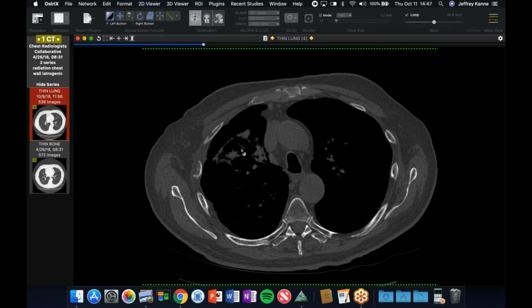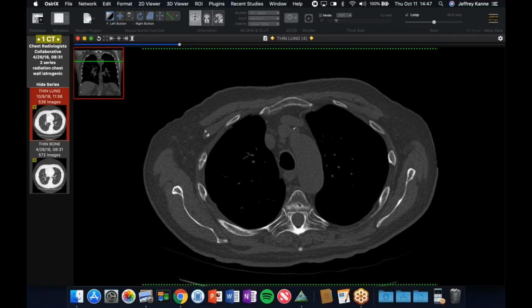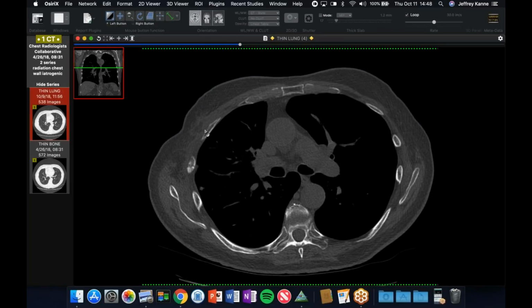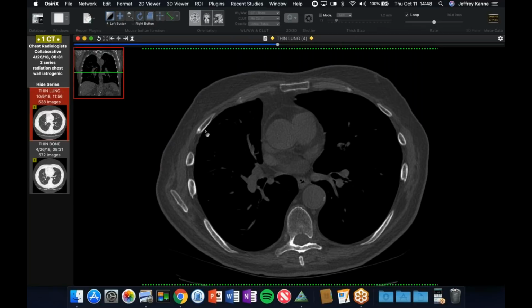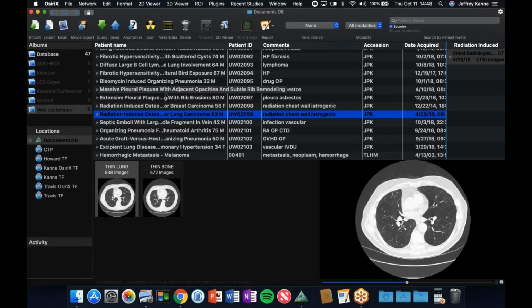Because with the SBRT now, if the lesion's more central, the isodose lines fall off fairly early as you get towards the chest wall. But this is something I always look for in our radiation therapy patients. And I've started specifically documenting in my reports that there's no radiation-induced fractures, just to remind myself to look for them, because every so often you'll get a call from clinic and they'll say the patient has pain at a certain point, and you go back and look and there's a subtle rib fracture there. So something to always look for, and it can allay any fears of chest wall recurrence. It's usually from just radiation osteitis.